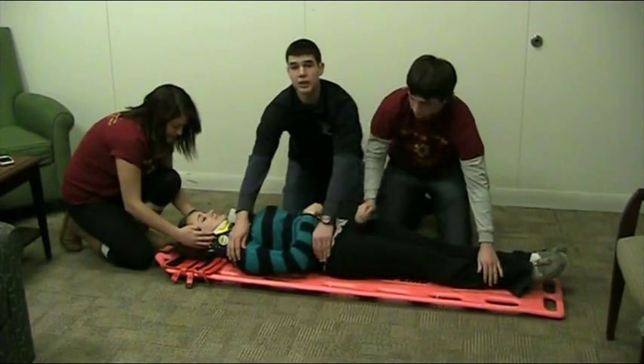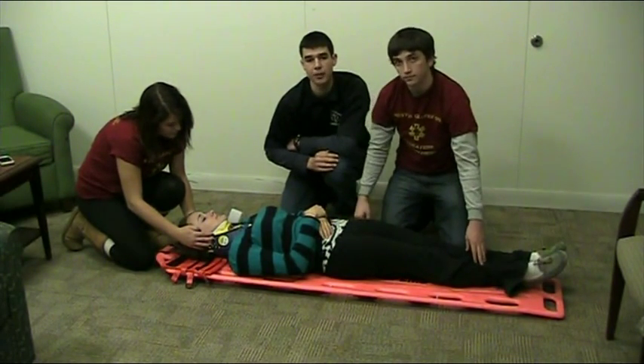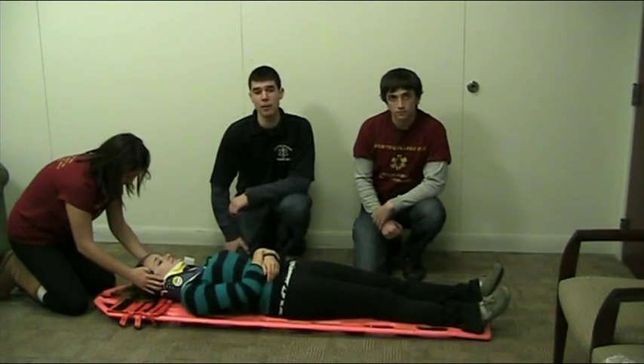Often times, when you log-roll a patient onto a backboard, they need to be readjusted. We will go over that in the next segment. After you have successfully log-rolled your patient, your next step is to make sure that they are centered on the backboard.